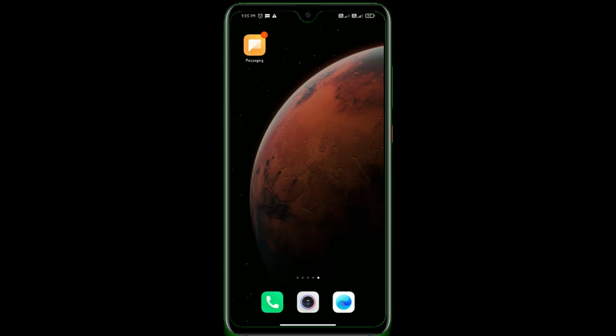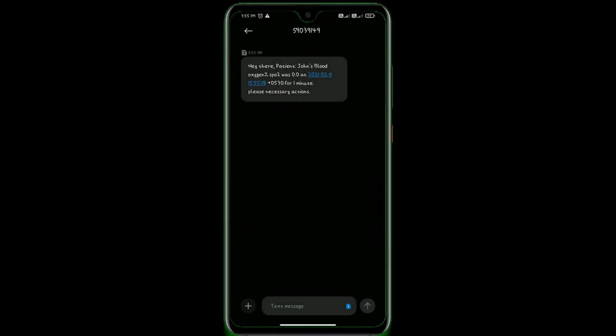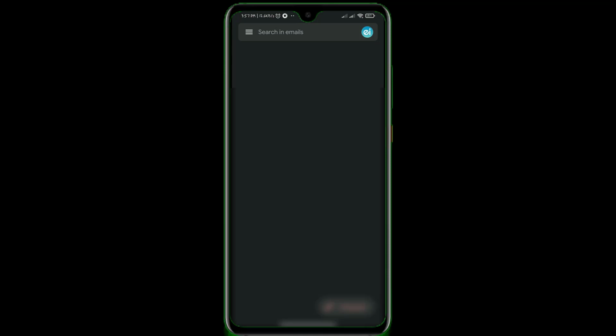That was amazing. What about SMS? Yeah, we have also received the SMS. You can read the text, which is the same as the configured one. We also received a Telegram message from IoT Notification. Maybe this IoT Notification is the bot created by Ubidots. Anyway, we have received the Telegram alert. Let's check the mail now.